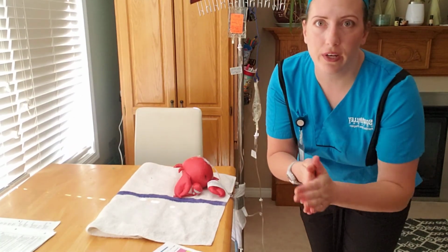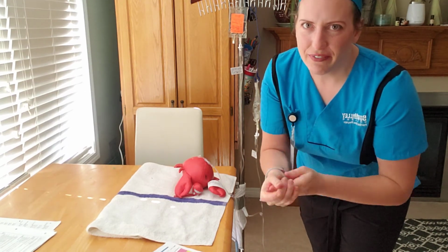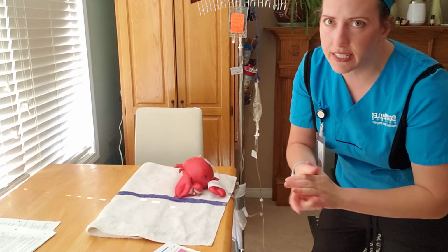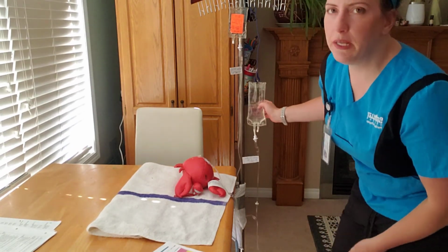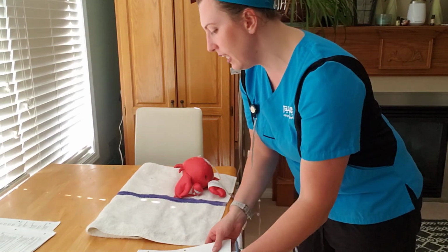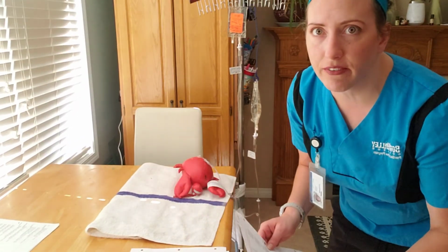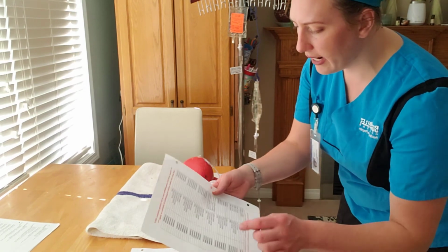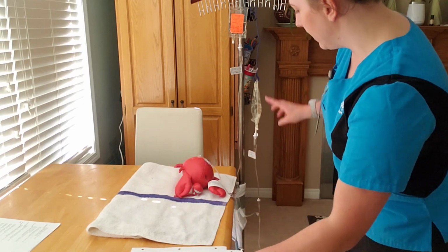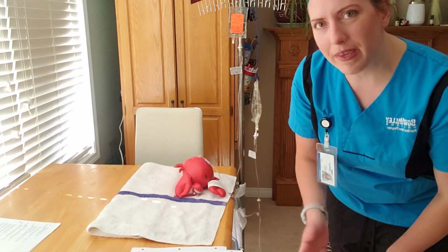This is about the time when I would go and do my charting. Oh, I forgot to mention, and this is something that obviously I did in my head, but I forgot to verbalize. I'm just remembering now that this saline bag that's currently running, what I would do is check it for compatibility to make sure that it coincides with the medication that we're giving. So 0.9% sodium chloride, again on the compatibility chart, is compatible with ranitidine. So because those will meet in the same line, we need to make sure that it's not going to have any adverse effects, and of course it won't because they are compatible.